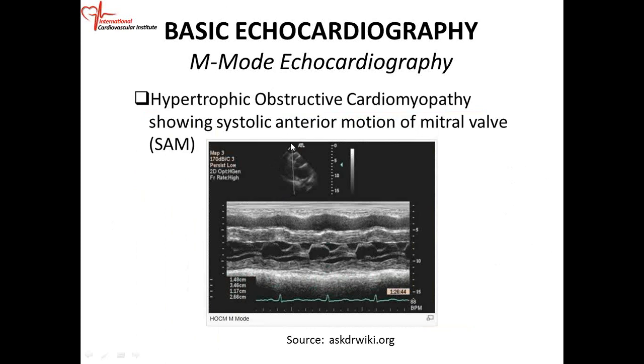These are the structures that the cursor passes through: chest wall, pericardium, RV wall, RV, septum, LV cavity, mitral valve, posterior wall. So these are the same structures. You can see chest wall, the pericardium, the RV wall is right there, RV cavity. The septum is a bit thickened. You can see that. You have to know what normal looks like to determine what abnormality is.